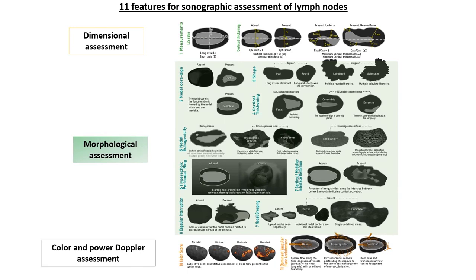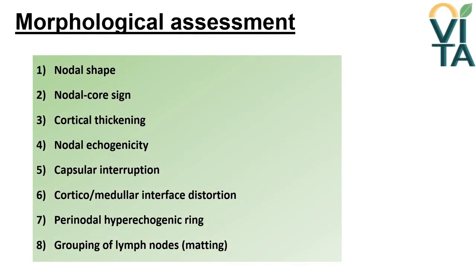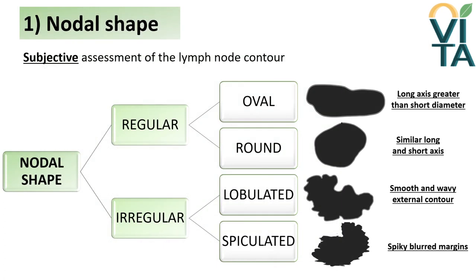Lymph nodes can be evaluated also by morphological assessment considering 8 parameters. Nodal shape is a subjective assessment of the lymph node contour. It can be regular — either oval or round — or irregular, which can be lobulated or spiculated. Oval lymph nodes have a long axis greater than the short one, while they are similar in round nodes. Lobulated shape is defined by smooth and wavy external contour, while spiculated lymph nodes have spiky, blurred margins.